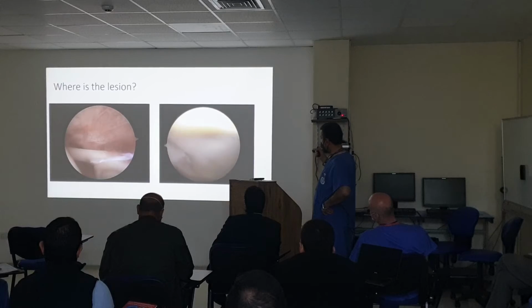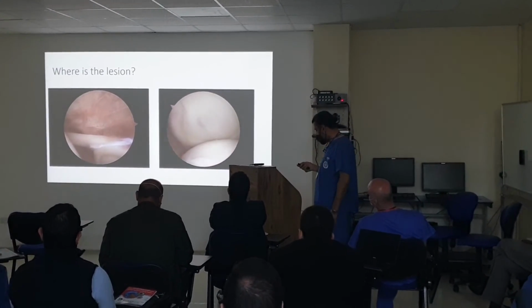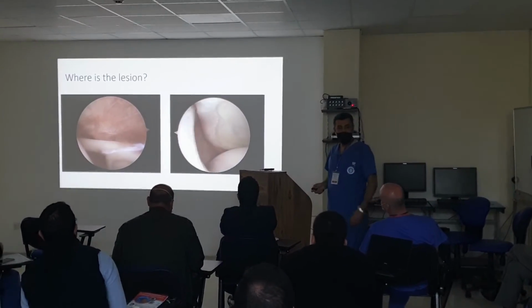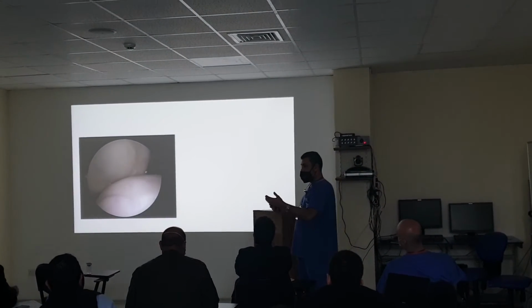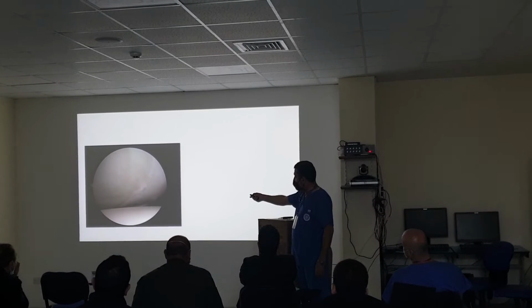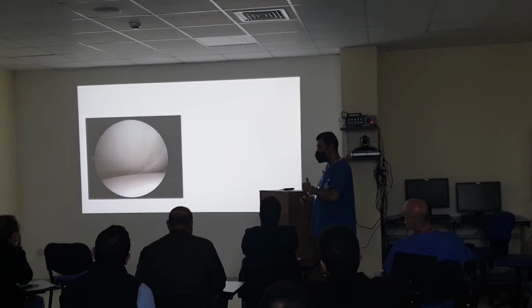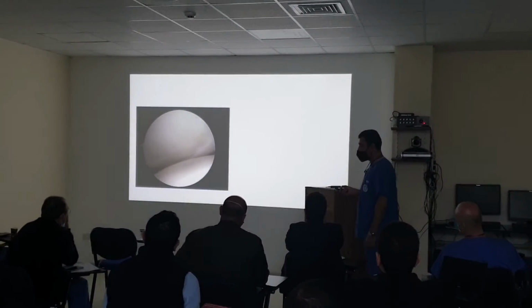So this is by inspection. You see, the glenoid is good, the labrum looks good. Anyone see something here? I think you have to probe. Yes, exactly. This is the point. So it's not enough to see. It's like in our clinical examination, you have to examine, and here you have to probe. You see? But what to probe? This is our tree of diagnosis. So you have to evaluate, know what you are going to do, and then do proper diagnostic arthroscopy.